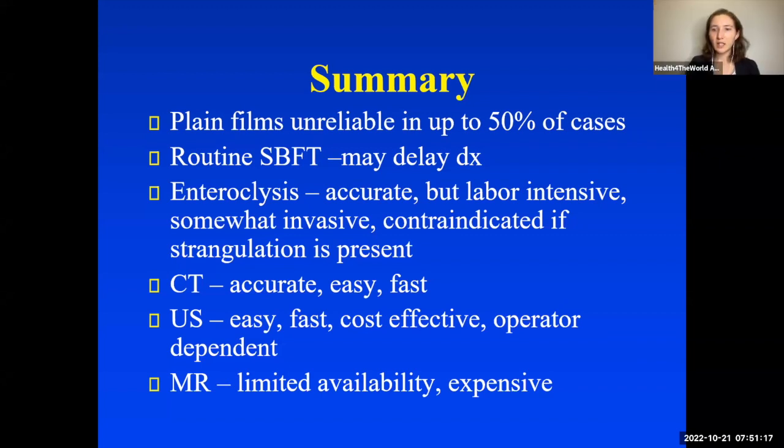Okay. And then another participant is asking, are there ultrasound diagnostic criteria for small bowel obstruction? Well, similar to what we do on CT, we're looking for those dilated fluid-filled loops of small bowel. We don't do too much ultrasound specifically for the diagnosis of small bowel obstruction.